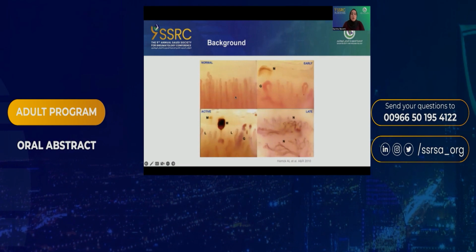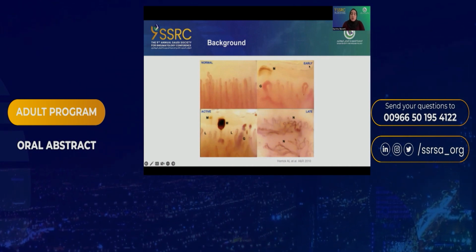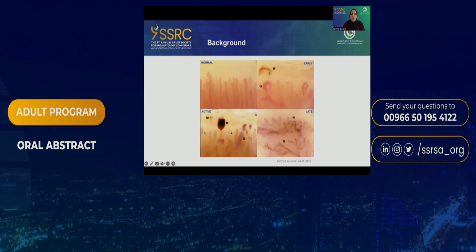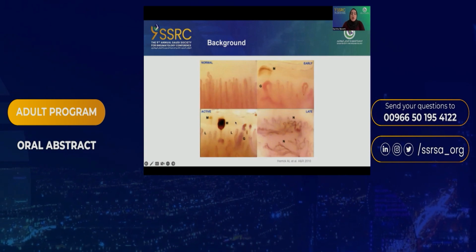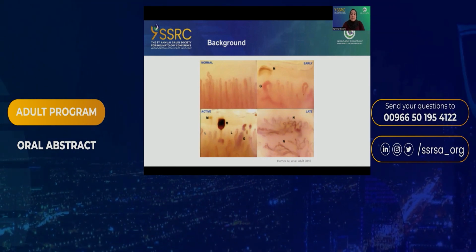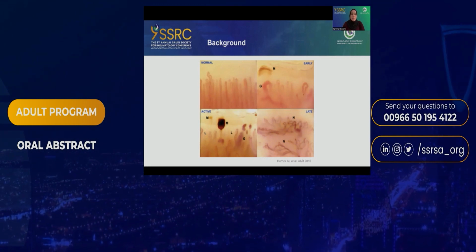So compared to the normal hairpin morphology and density of 7 capillaries or more in 1 millimeter, in the early scleroderma pattern, we see a preservation of capillary density, but the presence of giant capillaries and microhemorrhages. In the active pattern, we start seeing a decrease in capillary density and more giants, more microhemorrhages. While in the late pattern, there is a significant reduction in capillary density, and instead we see more avascular areas and areas of severe disorganization marking neoangiogenesis.